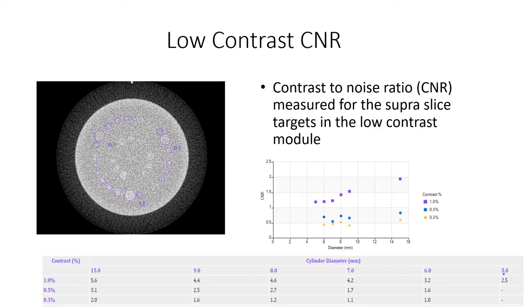Low contrast contrast-to-noise ratio measurements for the CTP 515 module with the 1%, 0.5%, and 0.3% contrast levels are calculated and charted for the 5 mm to 15 mm diameter targets.